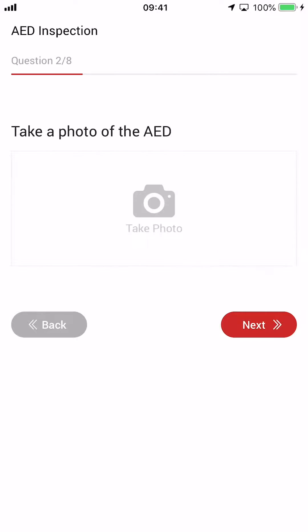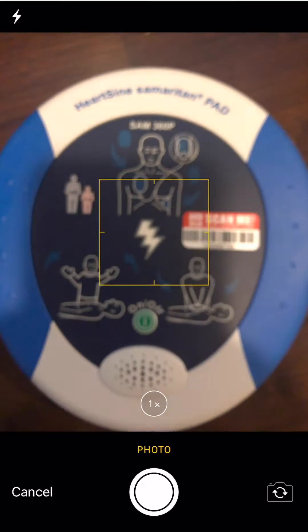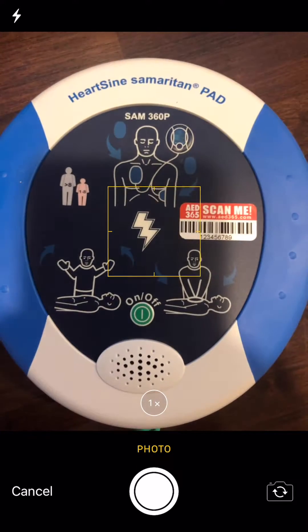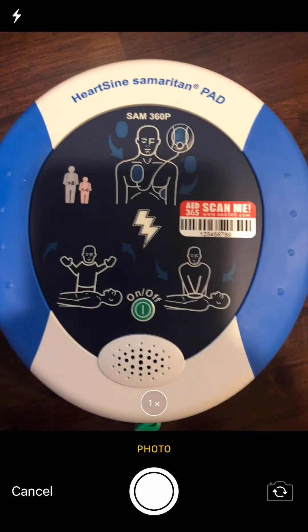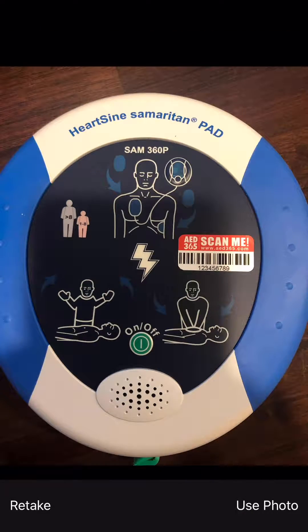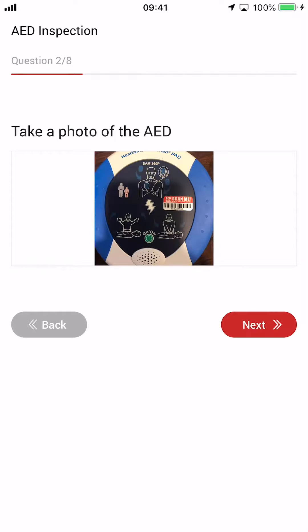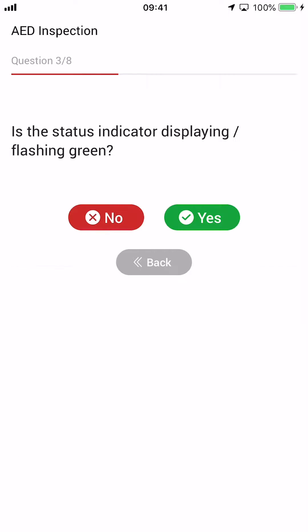Tap Next to take a photo of the AED. Choose either from your camera or the gallery and then upload a picture of the entire AED.